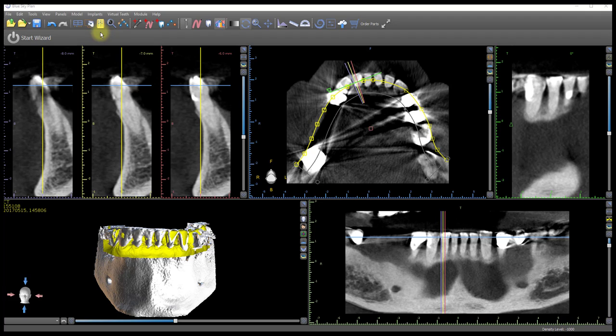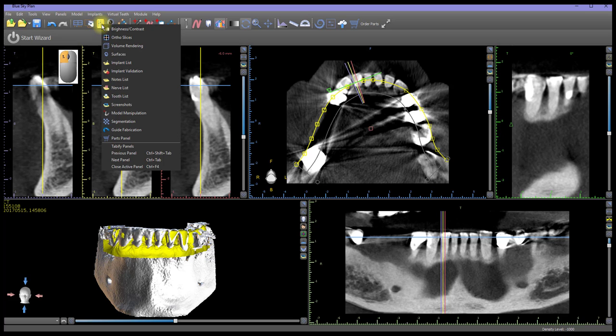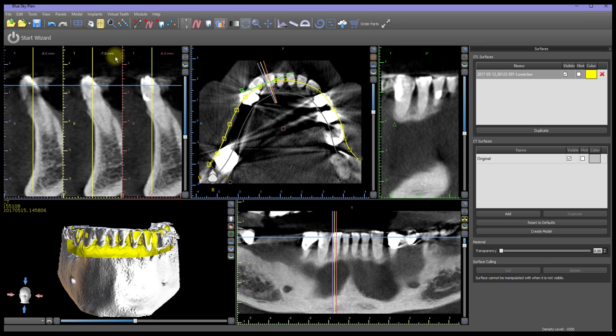The first step to remove a tooth from a model is to make the relevant model the only surface appearing in the 3D view. This is done in the Surfaces panel. To open the Surfaces panel, left-click on the Panels icon on the main toolbar, then left-click on Surfaces to open the Surfaces panel on the right side of the screen.